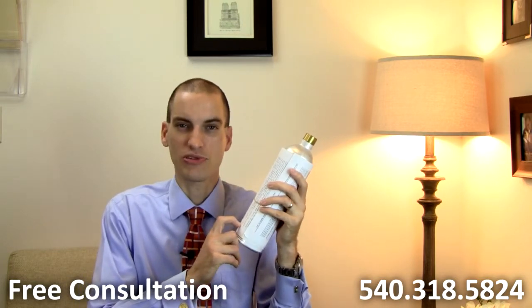So the dry gas, this one, is essentially made up of nitrogen, and it also has ethanol, which is of course a type of alcohol, at a specific known rate. In this example, it's 0.08%, which is the legal limit in Virginia. So in this cylinder is nitrogen with a mixture of ethanol, and when you put it through a PBT or the intoxilizer, it should read 0.08 because we know that this cylinder is comprised of 0.08% alcohol. And that's how we do a calibration or a systems check on the machines, to know that they're calibrated correctly to read the proper numbers.